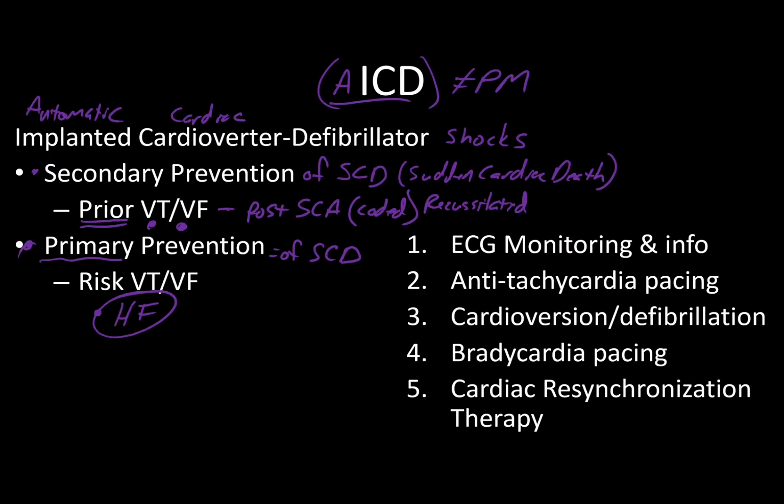The most important thing I want to share, and I giggle when I say this because I've had it happen, it hurts. The patients, they can feel it. In fact, I've had cases where a patient, it was malfunctioning and it was firing. Well, I shouldn't say it was malfunctioning. The patient kept going into VTAC because they weren't taking their meds like they should.